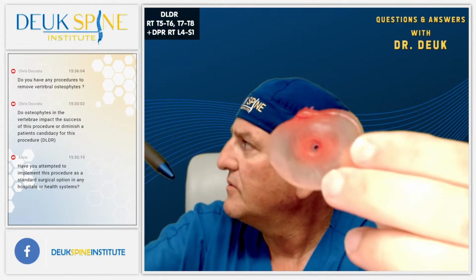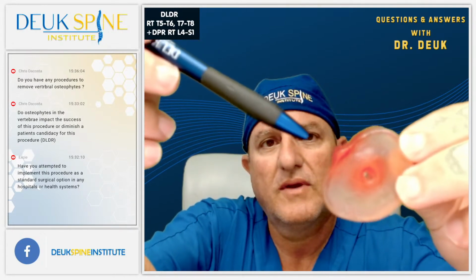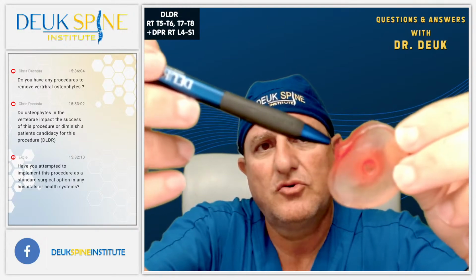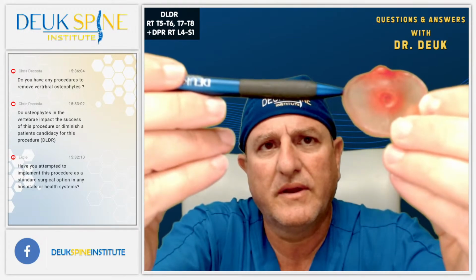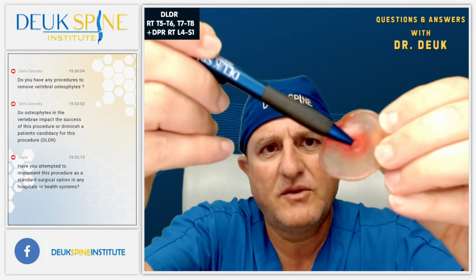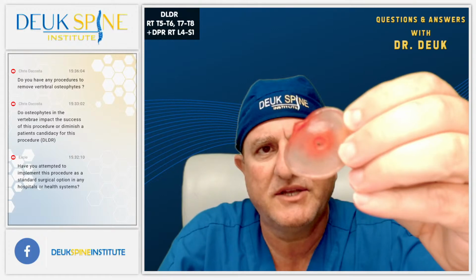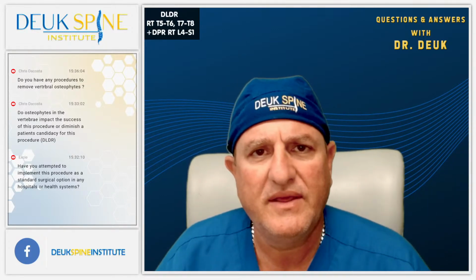So what we do with the DLDR is we actually come in right through the herniation and the tear. So this area is damaged already. We're not going through a normal area of the disc to fix this. We're going through the damaged area all the way in, and then we're pulling out. As we've come out, we zap and clean up the herniation. So the answer is no, we're not damaging in any way the disc.